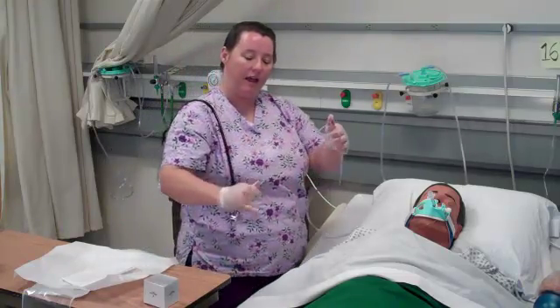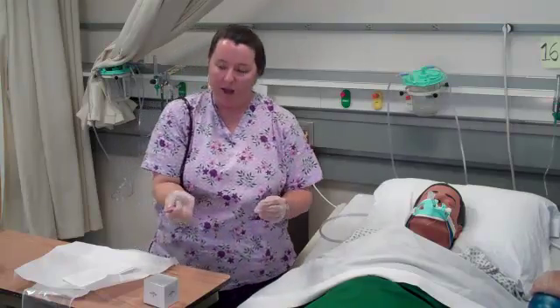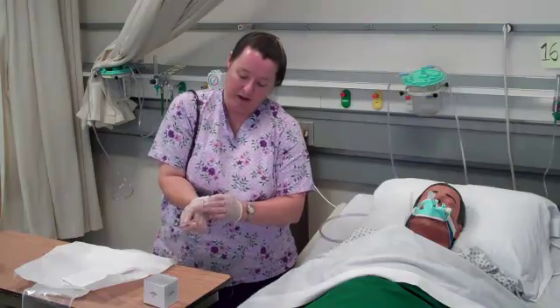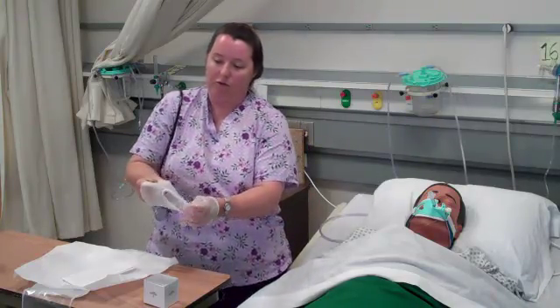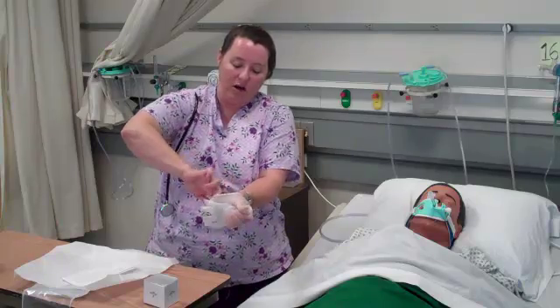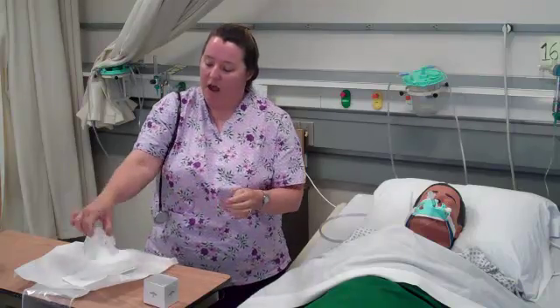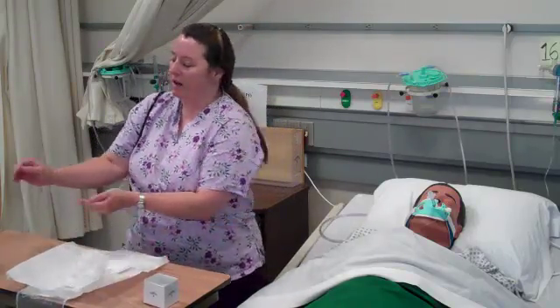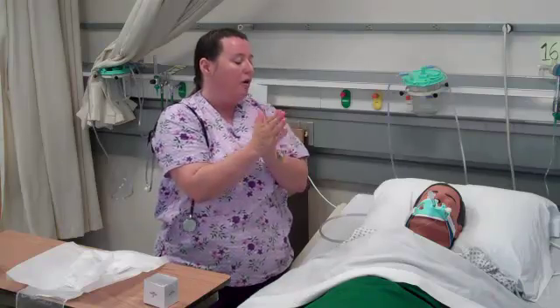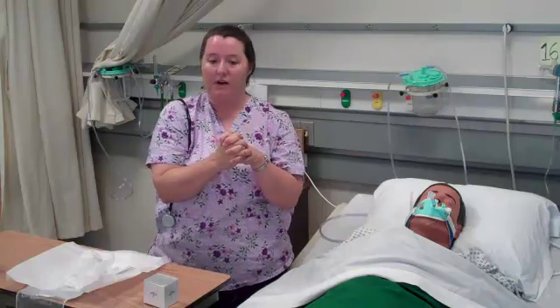I'm going to gather the catheter in my hand and remove the vacuum suction — turning it off. Now I'll remove my gloves: the tubing is in my dominant hand, and I touch dirty to dirty so I'm not touching my skin. I remove the catheter inside the glove, then reach under and pull the gloves over to avoid contact with any secretions. I'll dispose of the equipment and wash my hands. After washing, I'll reassess the patient, auscultate for lung sounds, check vital signs, and document my findings and what I have done.